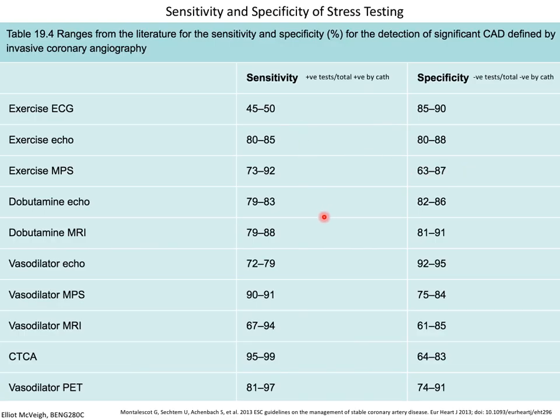And here's a table of where myocardial perfusion scans' sensitivity and specificity compare with other techniques. And I would take all of these numbers with a grain of salt, because all of these numbers are done in very specific situations where, probably the way the patients were selected modified the result for the sensitivity and specificity.